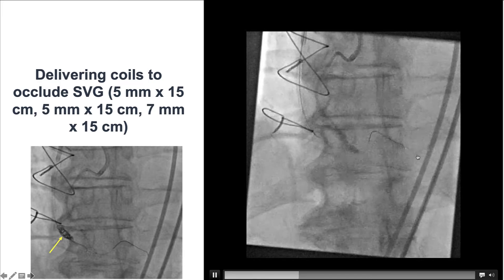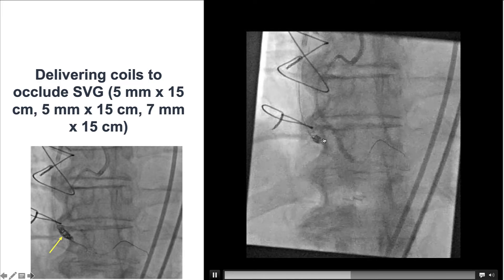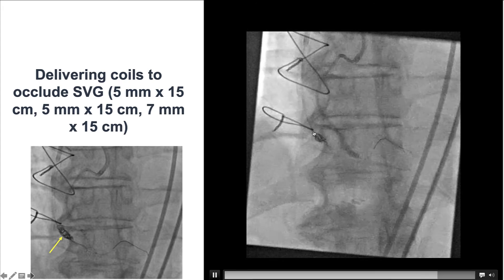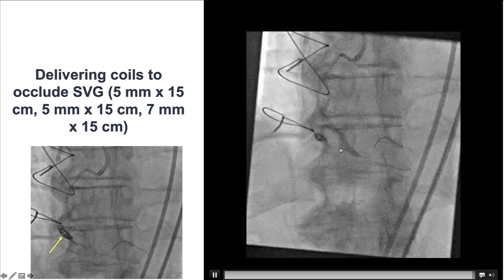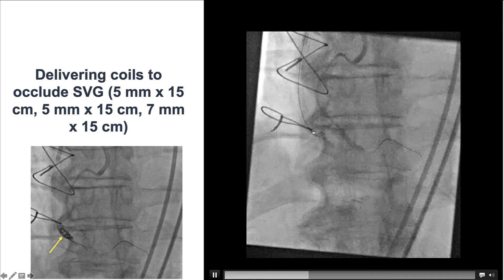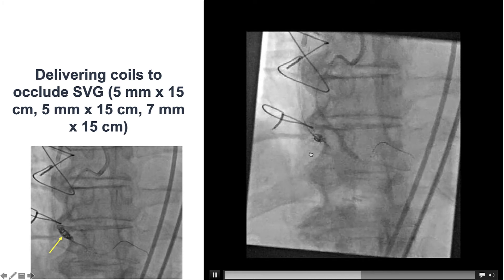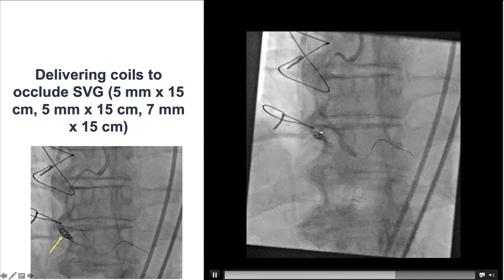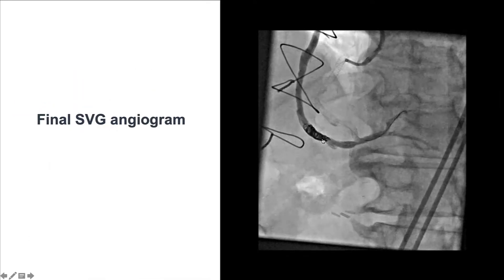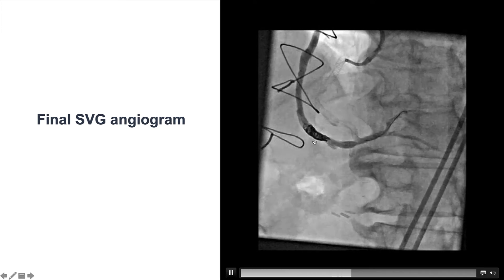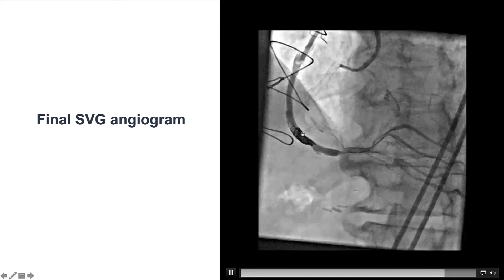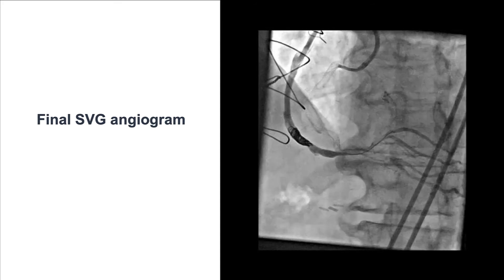We then decided to occlude the vein graft, because it had brisk flow. Whether SVGs should be occluded after being used for retrograde recanalization of a native vessel CTO is still debated. There is concern that competitive flow may lead to stent thrombosis, which is why in this case we used coils to occlude that vessel. The coils can sometimes take hours or days to close, with flow still present through the vein graft, but this could potentially close once heparin action is reversed.